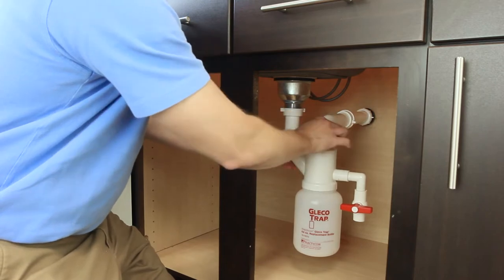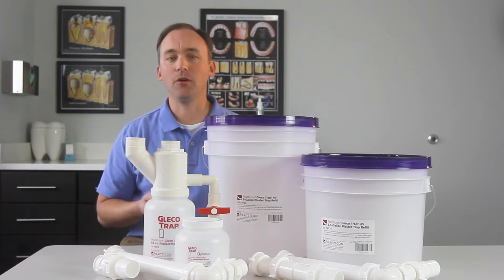Make sure all fittings and gaskets are tight to prevent leaks. It's important to note, if GlecoTrap is installed backwards, it may cause a backup into the sink.